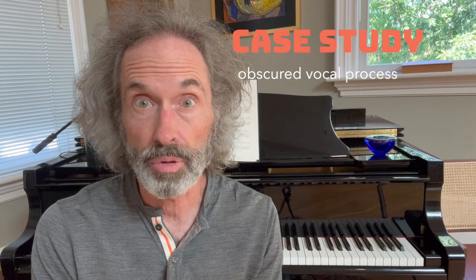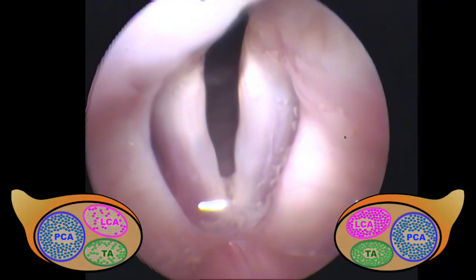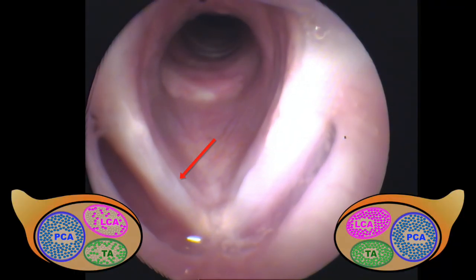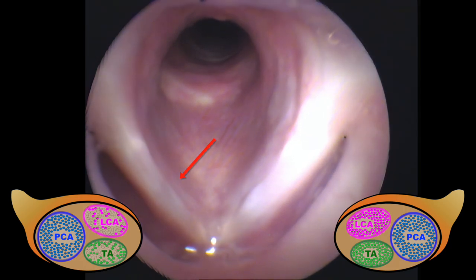This case is an example of why it's so important to see the posterior commissure. When you first look, the vocal cords don't come all the way together, but they appear to align and they vibrate fairly symmetrically. Her entire anterior branch of the recurrent nerve is affected, so both the thyroarytenoid muscle and the lateral cricoarytenoid are affected. When she breathes in, we can see how the right vocal cord is very atrophic. That's the weakness in the thyroarytenoid muscle.